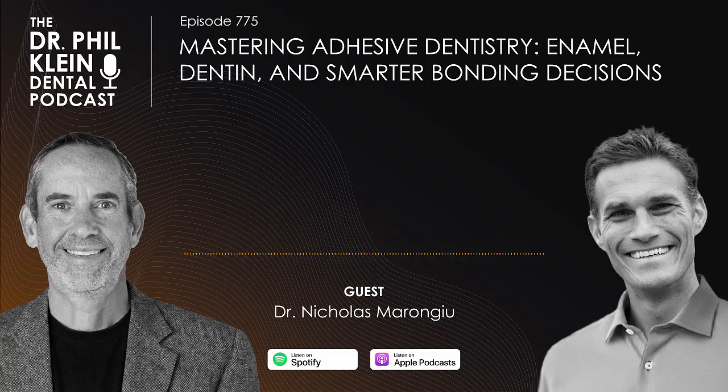If the crown or the indirect restoration is coated in resin on the intaglio surface, our bond failure took place at the natural substrate interface. And then that tells us, all right, well, let's go back to the basics on our steps. Where did we go wrong? Do we have an issue with isolation? Do we have contamination of blood or saliva? Did we wind up etching and damaging the dentin surface for that interface? Did we over dry? There's a plethora of things that could have gone wrong there, but at least it points us in the direction of where the failure took place.